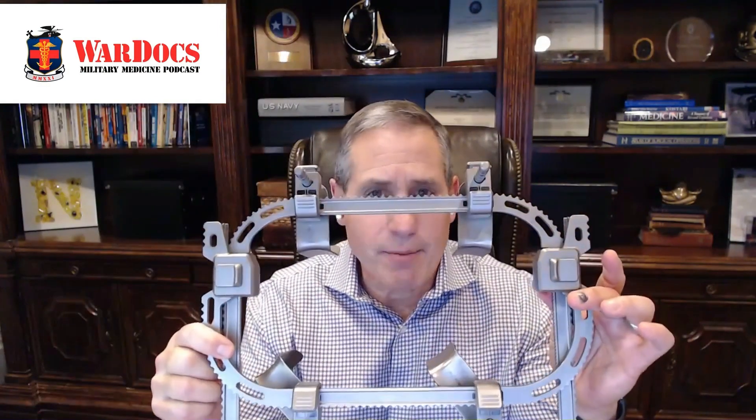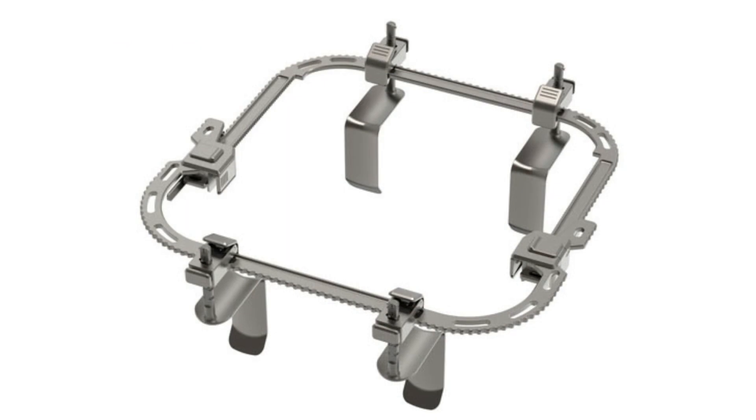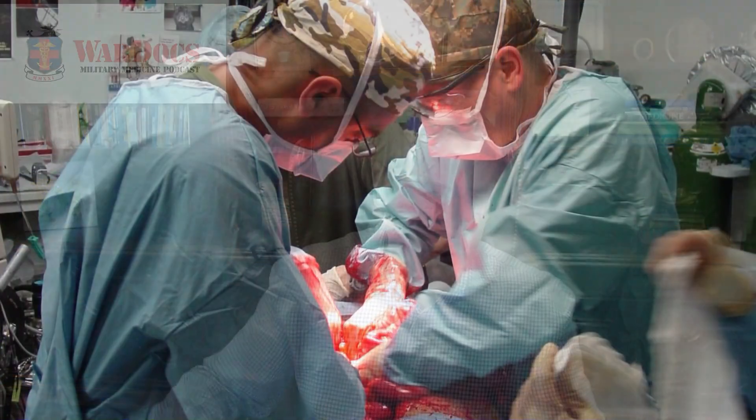First of all, we wanted to make it very light. And so it's all titanium. There's a system — there's 10 pieces. It can be assembled in about 16 seconds, which is our record. A couple of things we did: we made a one-way assembly, so the components can only be attached one way. They can't be attached backwards, as they can with many of our retractor systems. That's a frustration I think I've experienced, and other surgeons have experienced, when you get a hand a retractor that's been assembled backwards. We designed to address those common frustrations from the get-go.